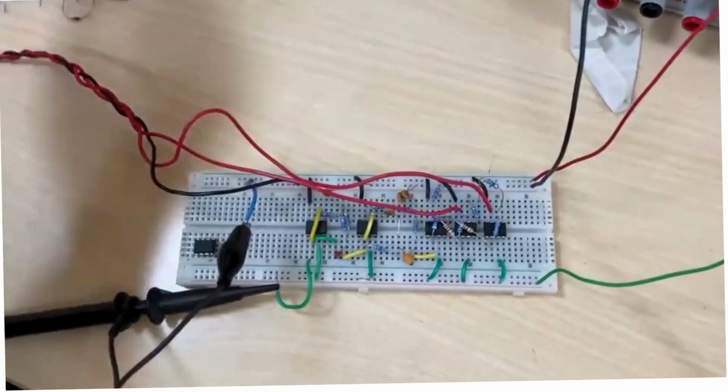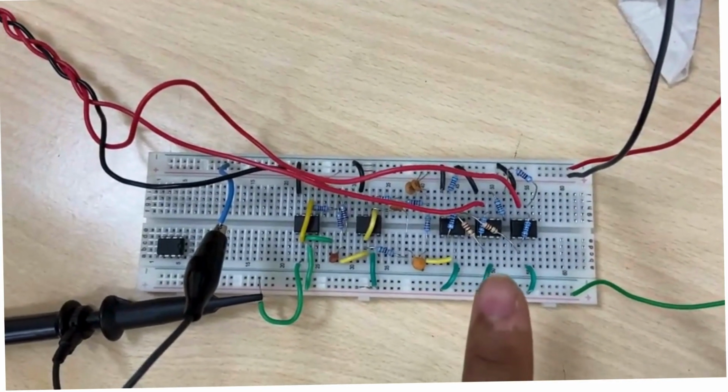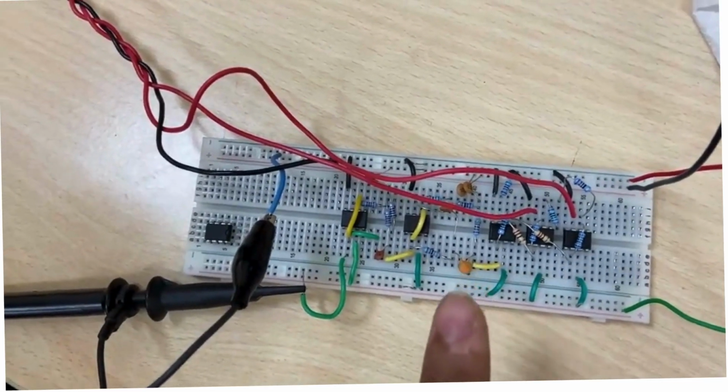Alright, so this is our video. Essentially what happens is that this is our entire circuit. The circuit diagram has been given in the report where we'll explain what each component of the circuit is and what function it essentially performs in the entire circuit.